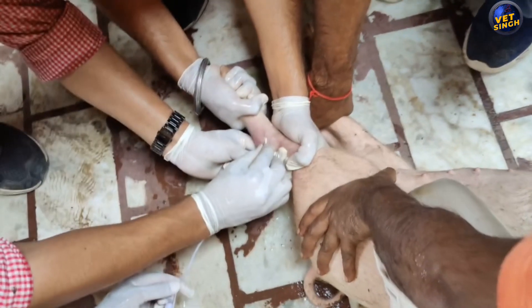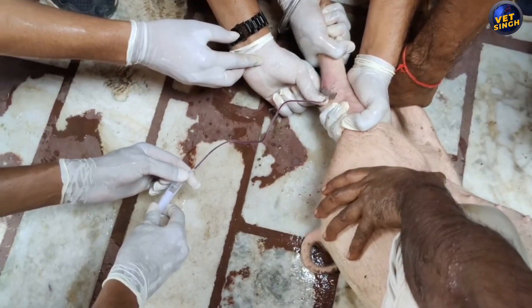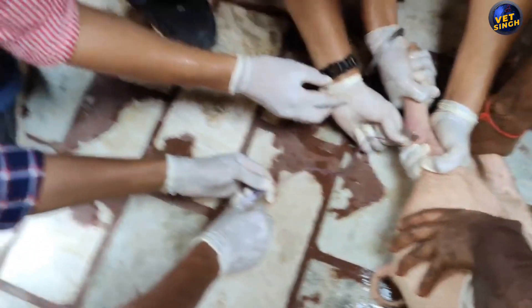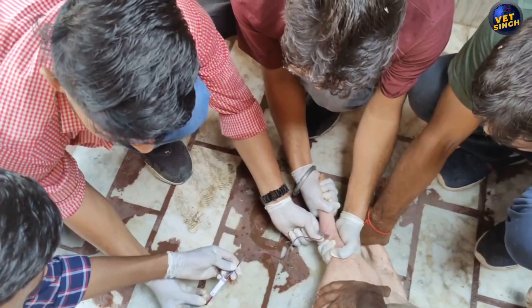Then checking that the blood is coming out from the SV set or not. As you can see, the blood is coming out from the SV set. In this video I want to thank Dr. Rohit, who is in the purple shirt, for helping me with the blood collection.